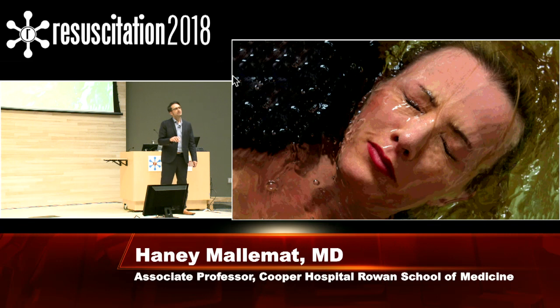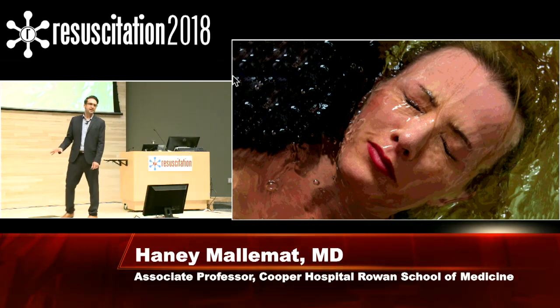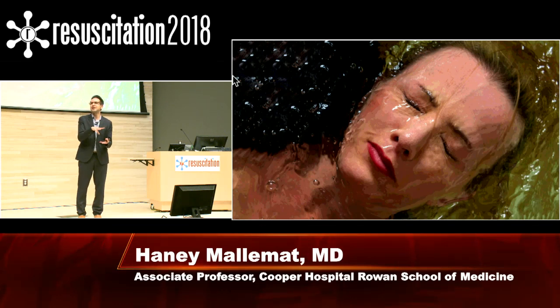And what do we say? Ma'am, you're sick. You're confused. Trust me, I'm a doctor. Try the mask. And they say, I don't want the mask. And you're like, try the mask. And they push you away. They say, I don't want the mask. You're like, just try the mask. Get some Haldol into them.